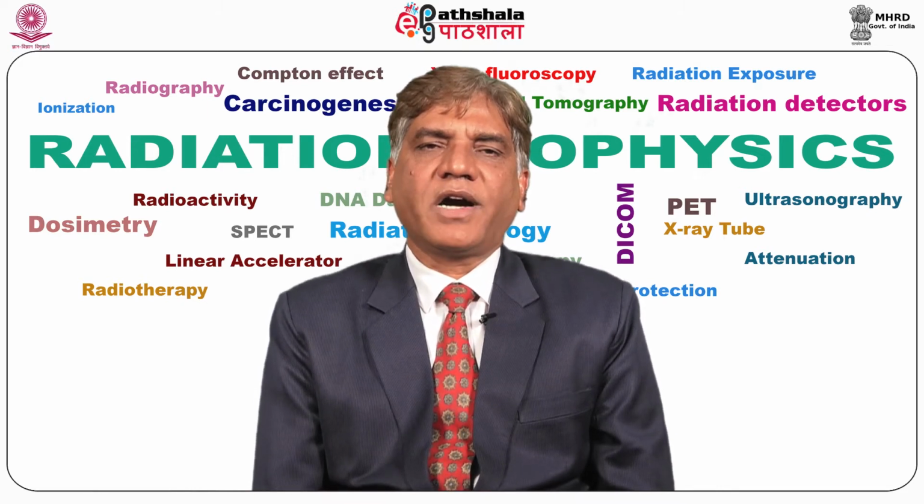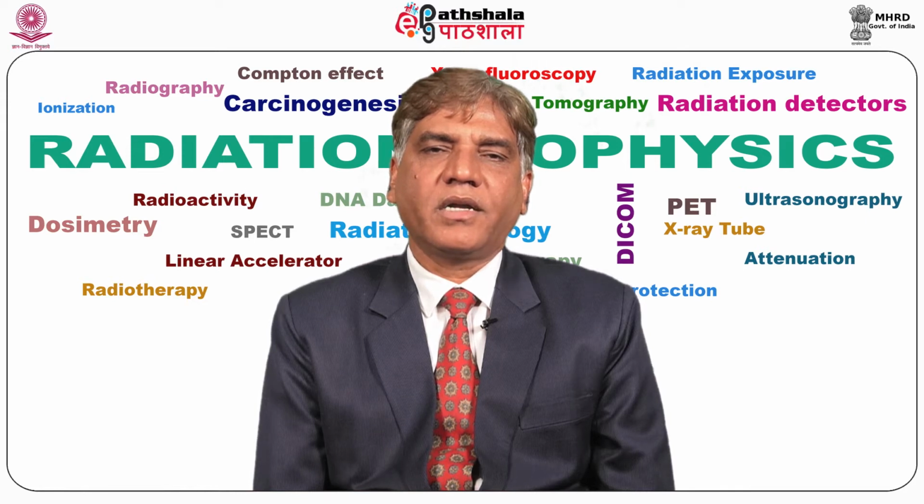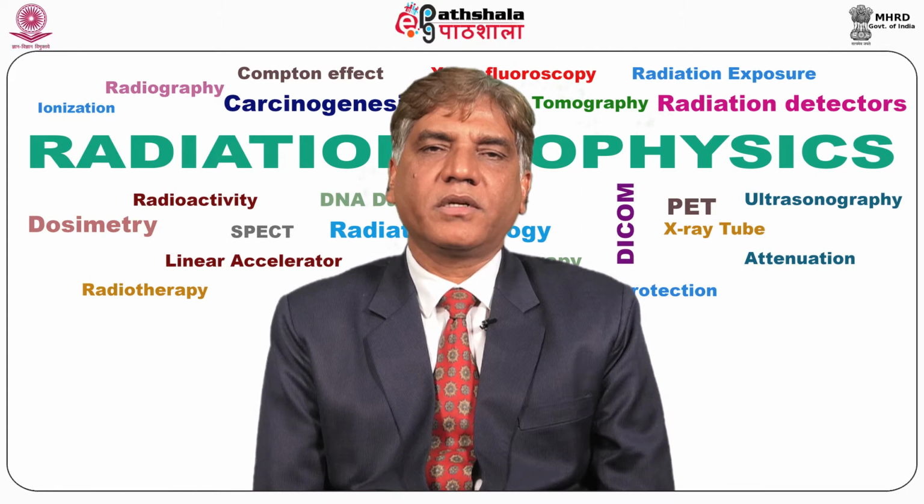Digital radiography is defined as a method of radiography in which the image is constructed from numerical data, and information is represented in the form of discrete units, that is, numbers, and involves the use of a computer. It uses a matrix to represent the image. Matrix is equal to the rows times the columns. The smallest unit of the matrix is called a pixel. Pixel is the stored individual grayscale value of an image.